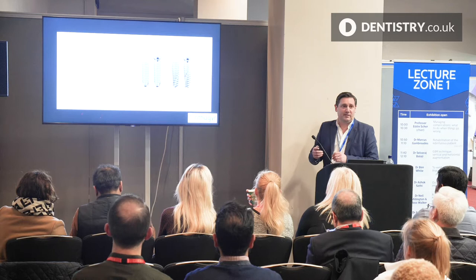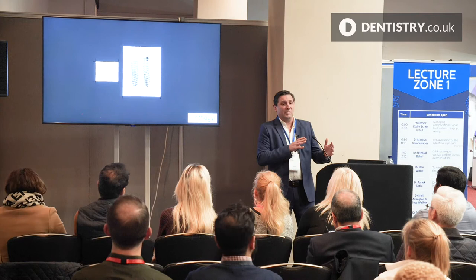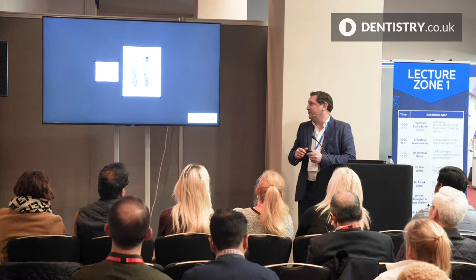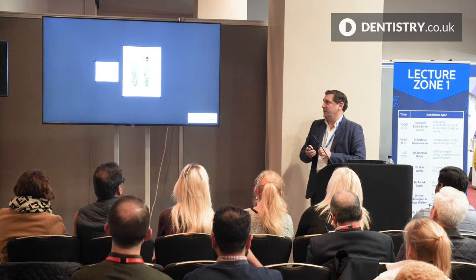Within my practice, however, I pretty much exclusively use the PX implant, mainly because it means we only have to have one set of implants. We don't have to carry two sets of stock. And it's unusual to want less primary stability. So the only instance where you might struggle with the PX because it's got such an aggressive thread is in dense bone, so lower anterior mandible. But we can adjust our protocol there so we can still use the PX there. So it allows us to use just a single implant rather than having to carry two different types of implants.